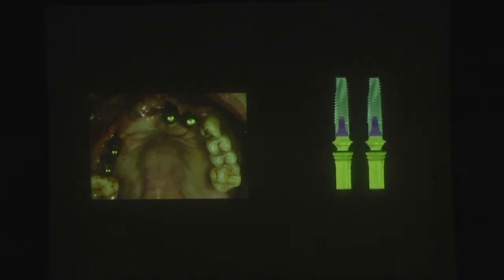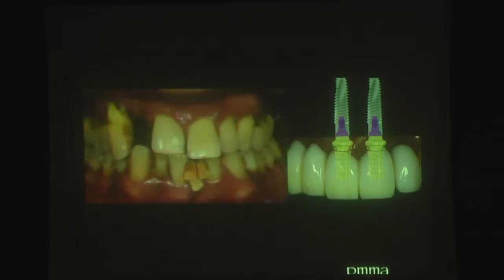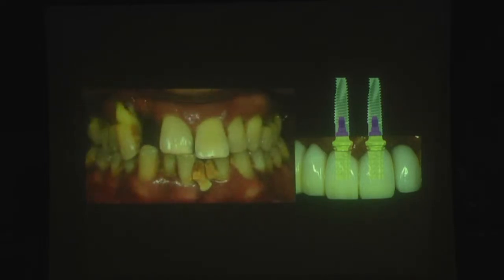And after it, we put the impression copings on top of the multi-unit abutments, and we place 2 implants, the multi-unit abutments, and temporary cylinders as temporary abutments, which are made of titanium. Then place the PMMA temporary crowns on top, and it was like this. And after the operation day, it became this way.